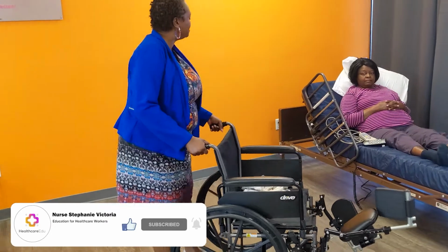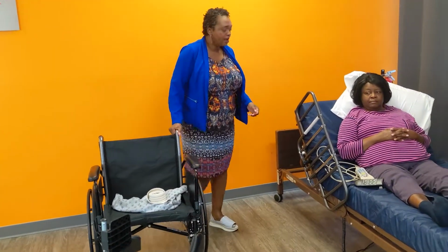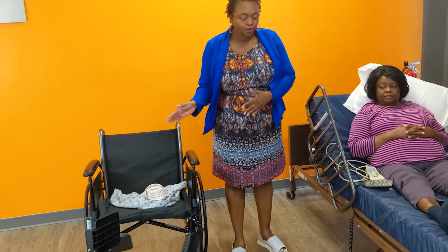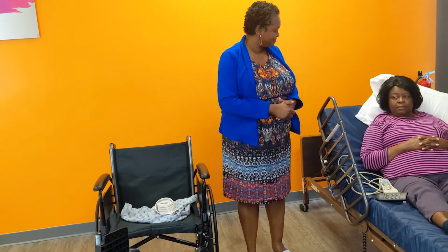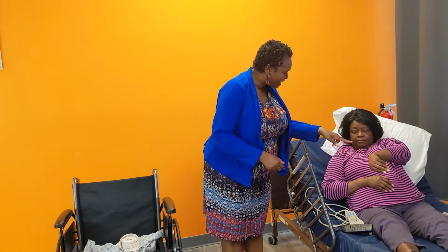So knock, knock. You always knock prior to entering. And now I'm going to announce myself. Hi, my name is Stephanie. I'm your CNA today. And I'm going to help get you out of bed to the wheelchair. Is that all right? Okay. Can I see your two identifiers? All right, so that's the intro you do for every skill.